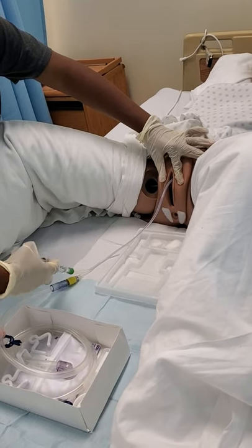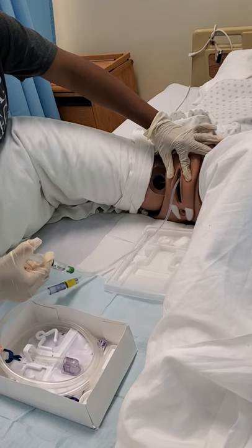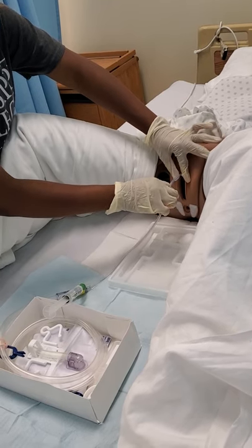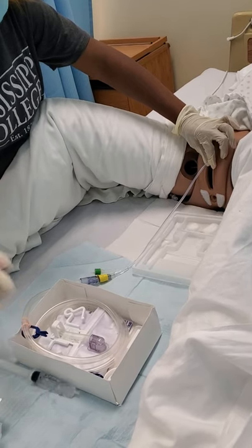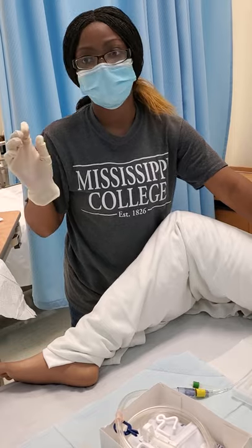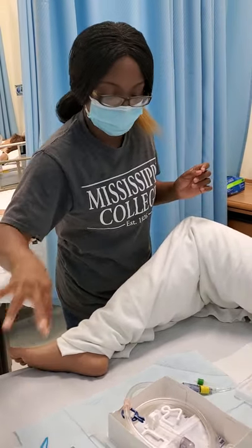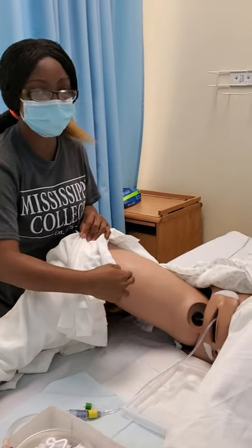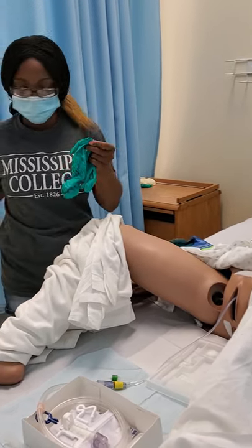All right, now I'm going to inflate the balloon. To see if it's secure, and it is. All right, now I'm going to hold the catheter with the other hand. Now I'm going to take this off, and now I am going to remove my gloves. Now I'm going to get some tape so that I can attach the catheter to her leg. Don't have my disposable gloves.